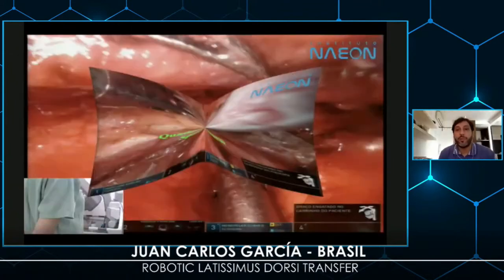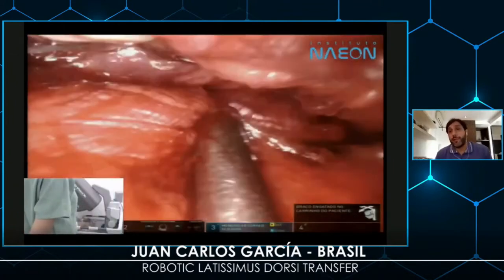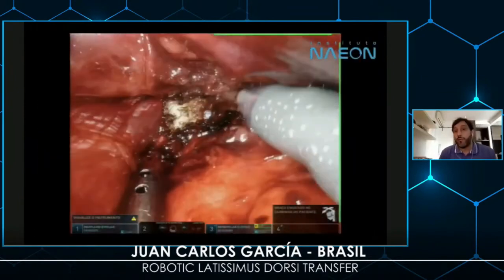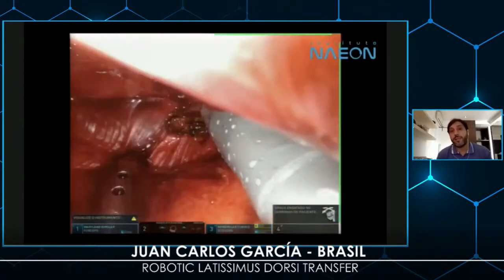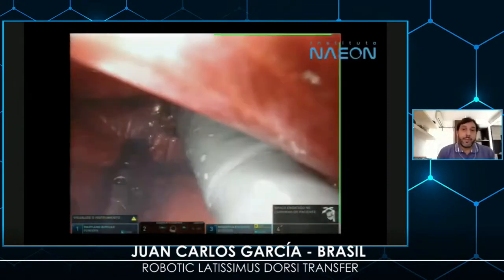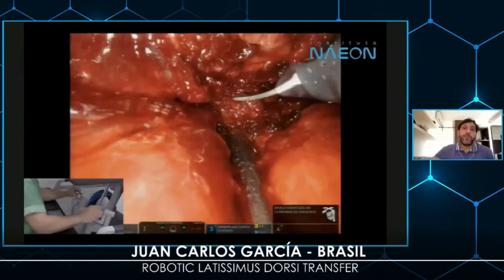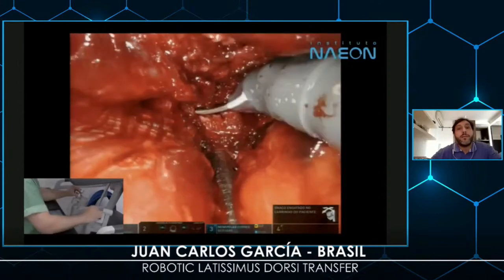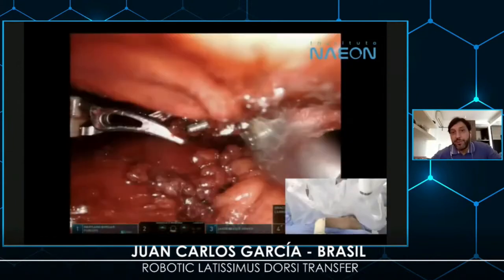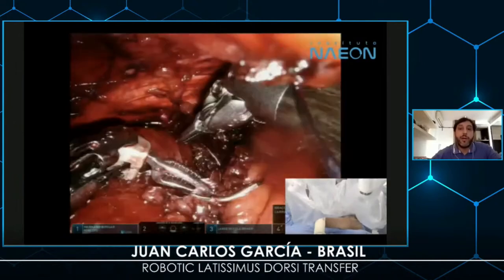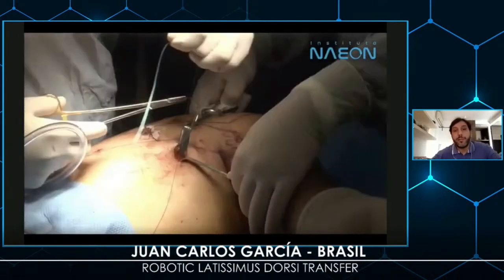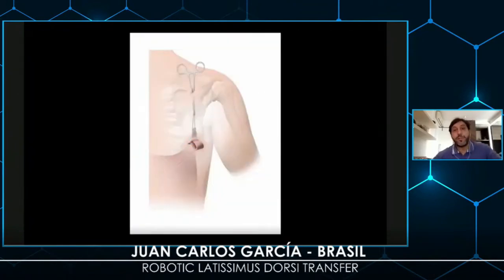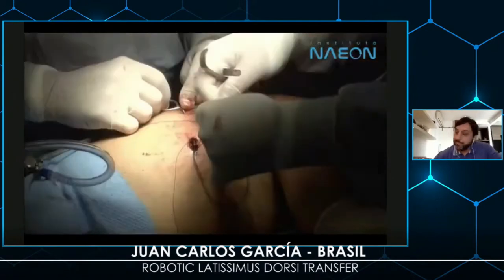For a patient with stroke, we start by showing the quadrangular space and the latissimus dorsi. In this patient we did just the latissimus dorsi transfer because he had a different kind of scapular dyskinesia. We are cutting the latissimus very near the bone. It's a very cautious use of the scissors, suturing again, putting out of the body, and making the sutures out of the body, then passing to the scapula to treat the scapular dyskinesia.